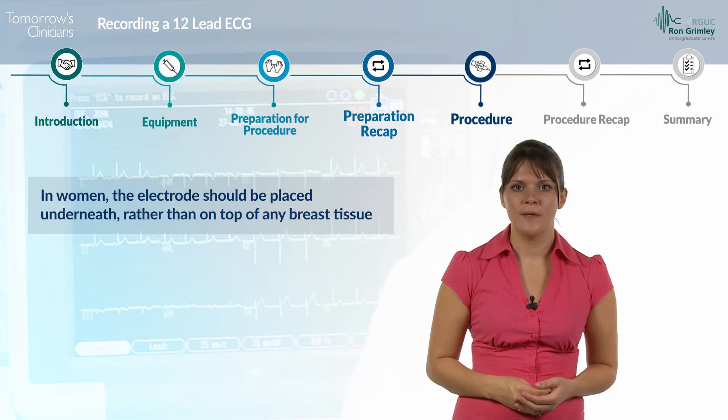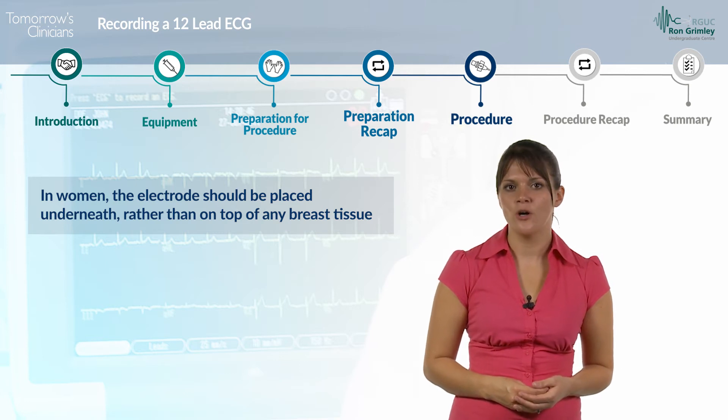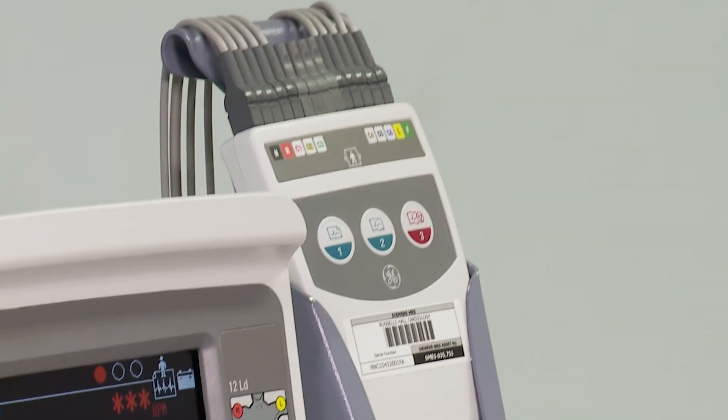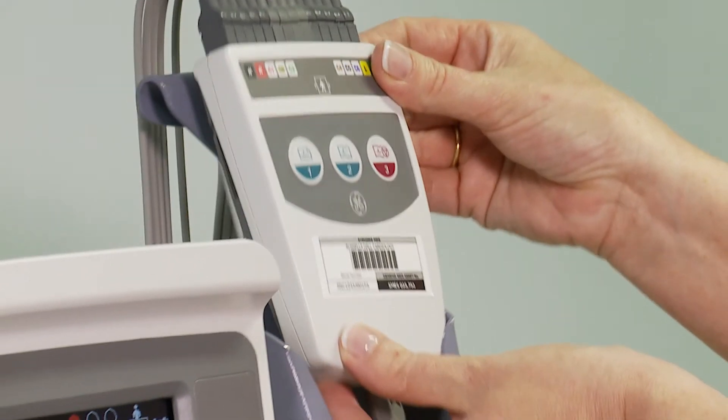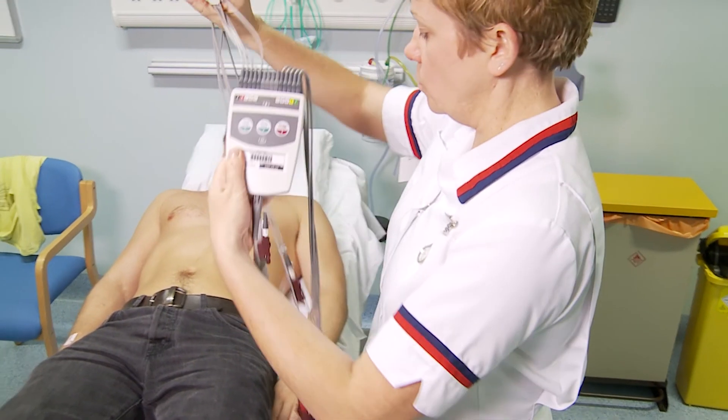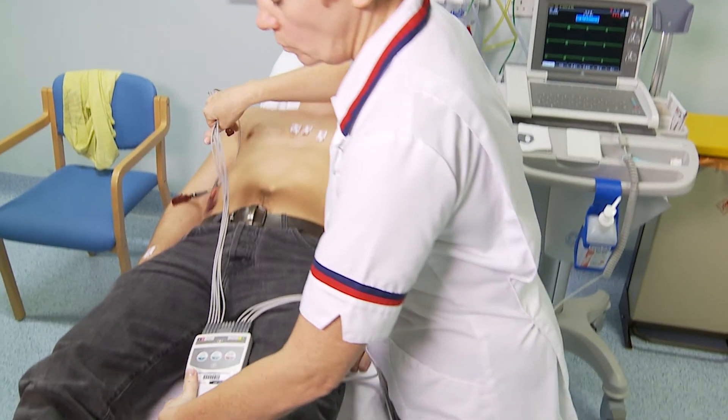In women, the electrode should be placed underneath rather than on top of any breast tissue. Once the electrodes are in place, connect the lead clips to them. You should ensure that the leads are correctly connected to the corresponding electrode tabs. The leads are clearly labelled to enable this.